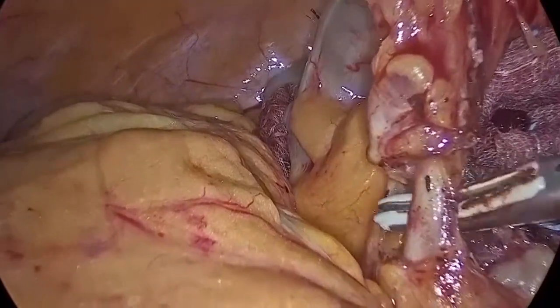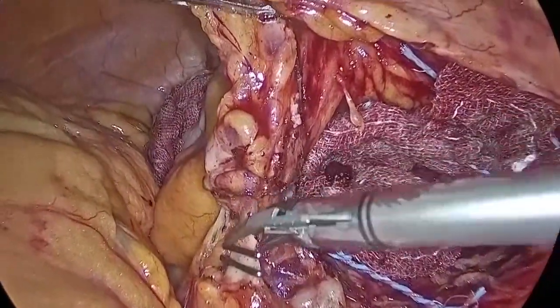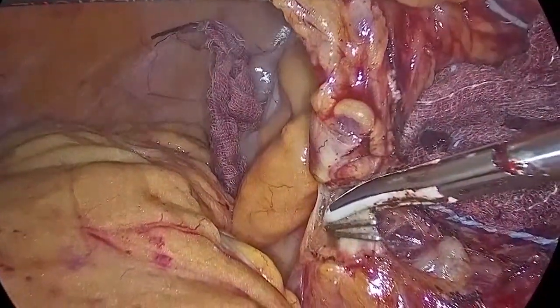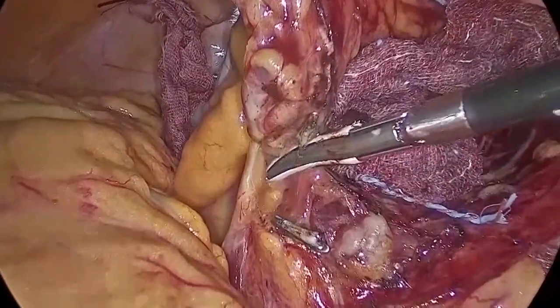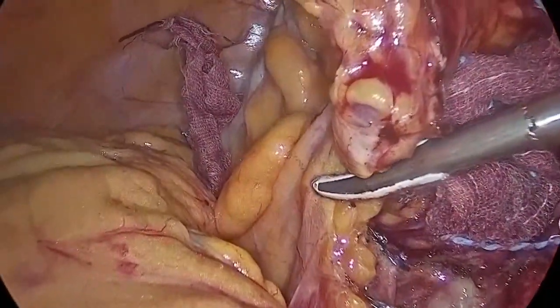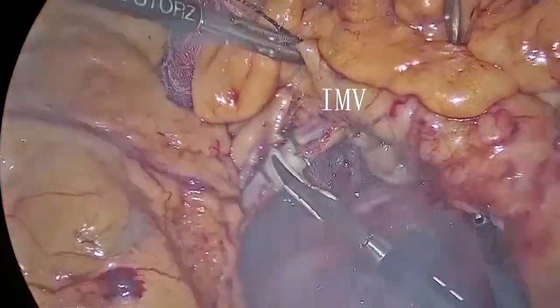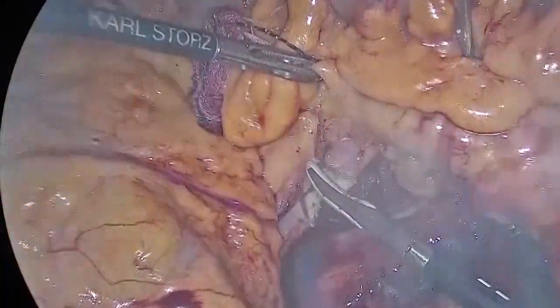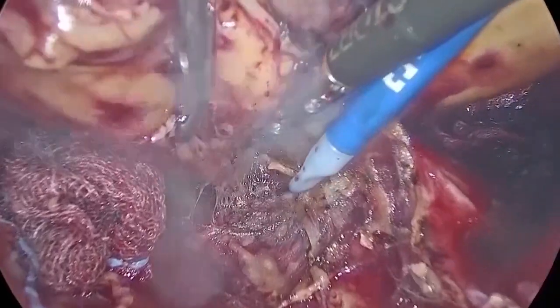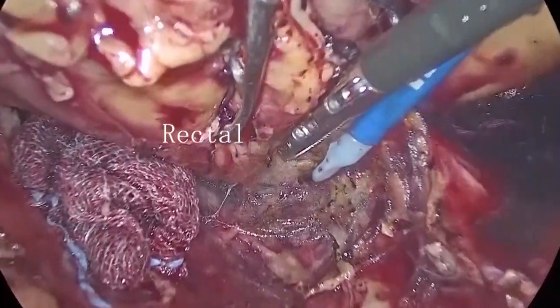Using a medial to lateral approach, the inferior mesenteric artery was sealed and divided along with lymph node dissection. Ligation of the inferior mesenteric vein was performed. The posterior rectum was mobilized while preserving the TME plane.